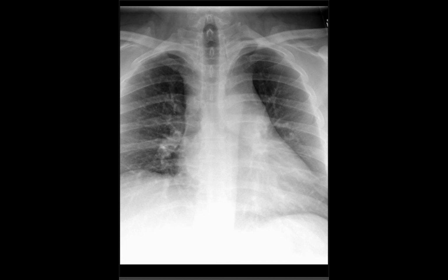It said all these lesions may represent calcified thrombi. The clinical presentation does not suggest this. Thus, we call it calcified amorphous tumor. So it's basically calcified thrombi, but they can't explain the calcified thrombi, and so they name it something. Instead of saying just idiopathic calcified thrombus, they have to give it some fancy name.